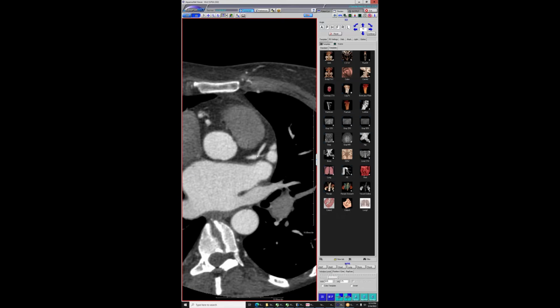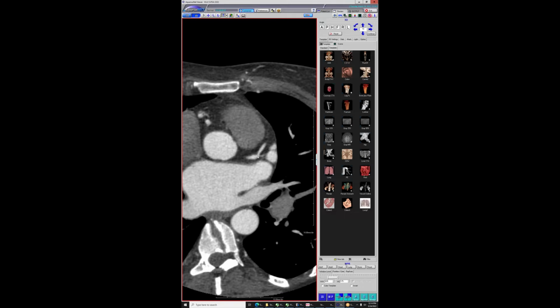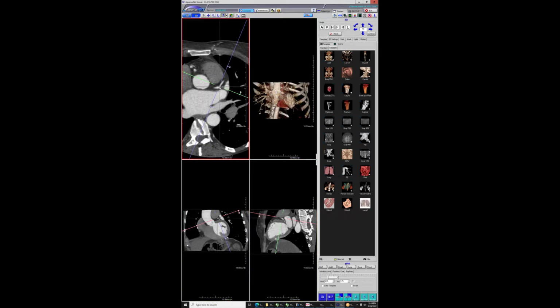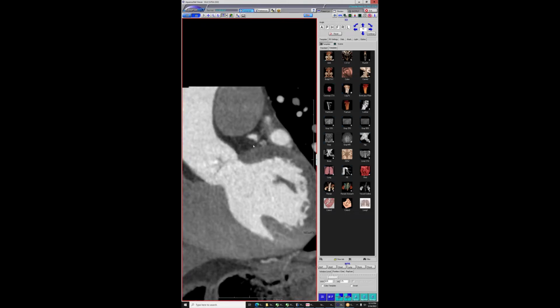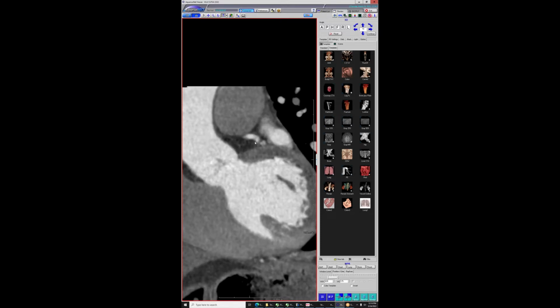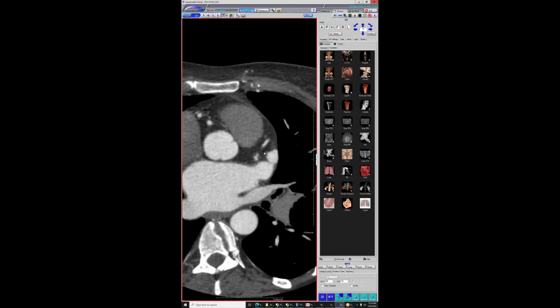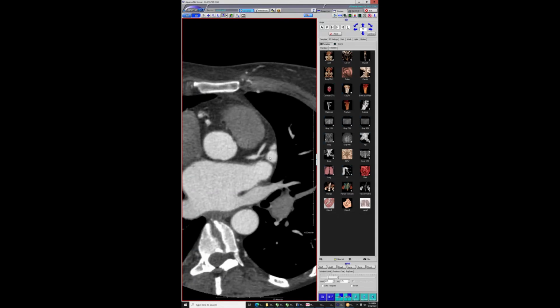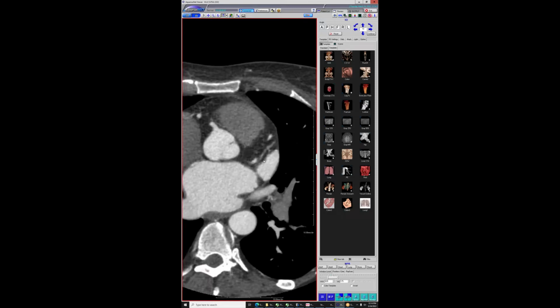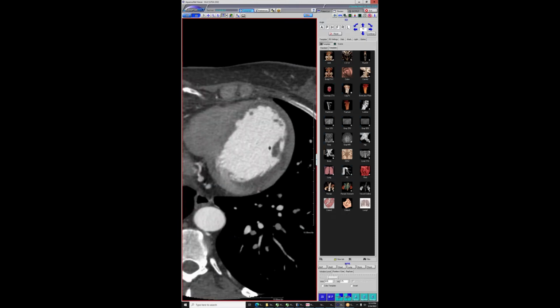But if you go into this area around the distal left main going into the LAD and left circumflex, you do see this abnormal soft tissue at the ostium of the distal left main. This is not normal, the circumferential soft tissue here. It's also around the circumflex, and you can even see it going into the ramus here. Even though they're calling it vasospasm, we really think this is going to be a type 2 or 3 SCAD, depending on if it's a focal SCAD or if there are other areas of involvement, which makes much more sense than a vasospasm.